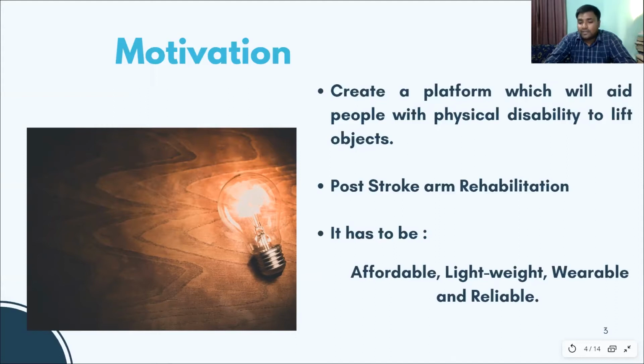Second one is lightweight. Lightweight is an important thing because it will be a wearable device. If it is lightweight, then the user will feel comfortable using it. And the fourth one is reliability. As it will act as a part of our body, it has to be reliable.